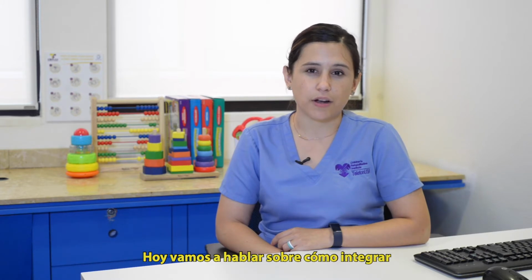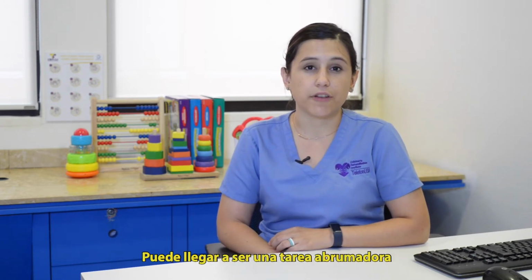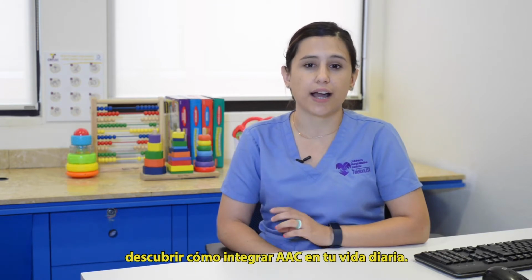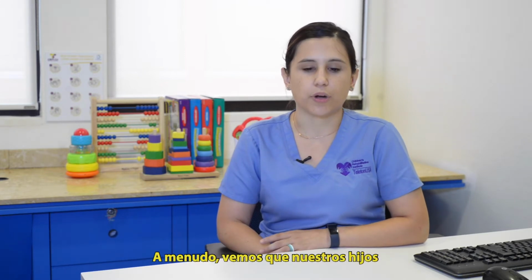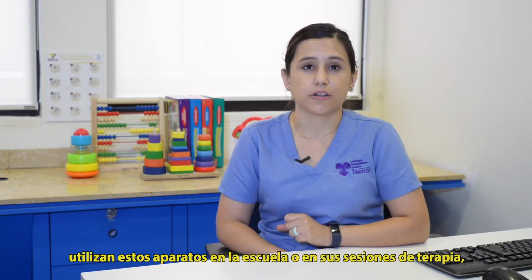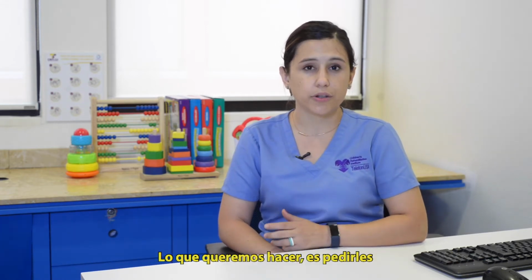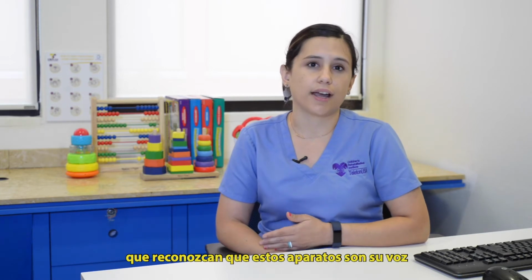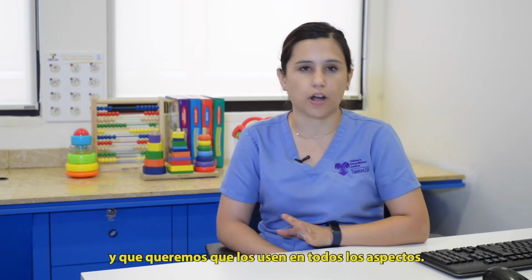Today we're going to talk about how to integrate AAC more into your daily life. It can be a very overwhelming task to figure out how exactly to integrate AAC into your daily life. Often we see our children use their devices in school and in therapy, but rarely use them outside of those two places. So what we want to do is have them recognize that the device is their voice, and we want them to use it across all aspects.